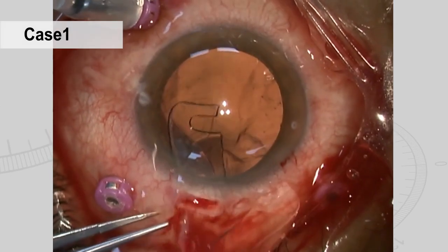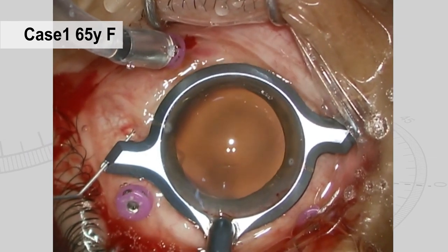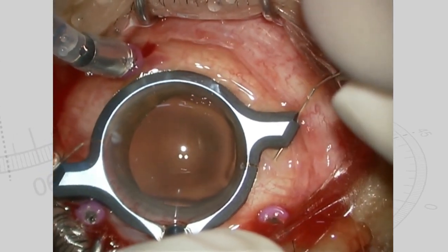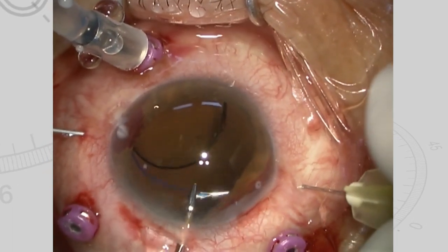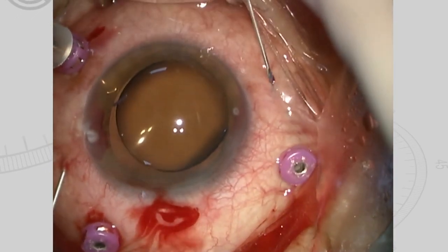We will show you two case examples. Patient 1 was a female, aged 65, with IOL dislocation. After performing vitrectomy, we cut the dislocated IOL and extracted it. Using a needle stabilizer, we pierced two thin 30-gauge needles and inserted the IOL haptics into them. We then pulled out the haptics along with the needles.